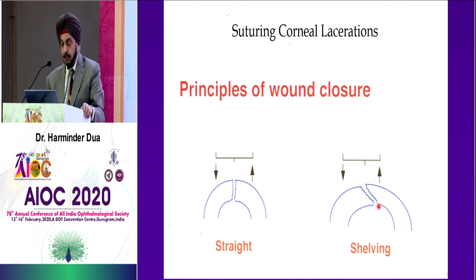So what you would do is, it's very important that the distance from the edge on the underriding part of the wound is further away than on the overriding, so you get the right compression to bring it together. If you look at the forces that are applied, it is also written, and probably rightly so, that if you take the internal edge, the internal part of the wound as the center, you could then probably place your sutures around that point rather than around this point, and you can get equal compression. But this is what I follow: go further away from the underriding edge and closer to the overriding edge.